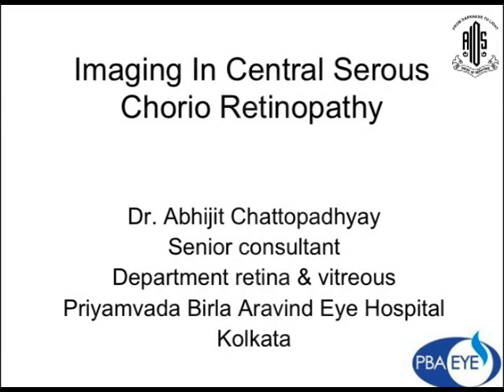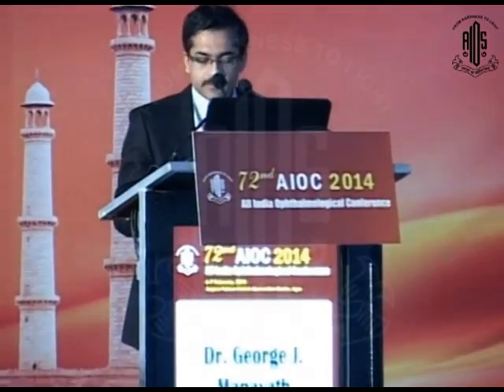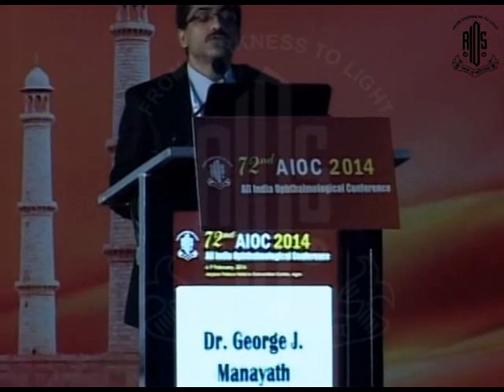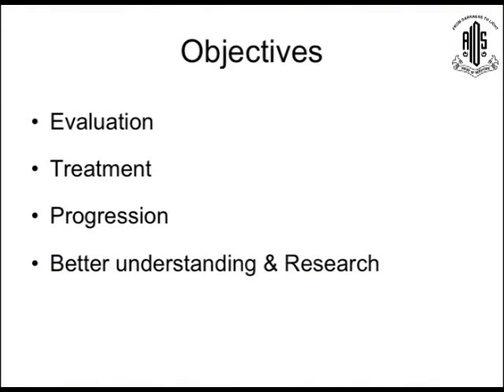Good morning, everybody. So, my topic is imaging in central serous retinopathy. I will try to avoid the repetition as much as possible, as Dr. George already pointed out. The objectives of imaging in central serous retinopathy are evaluation of the disease, treatment, progression of the disease, to better understand the disease, and of course for research purposes.